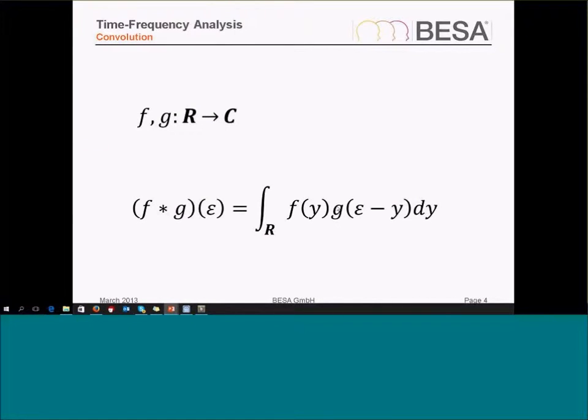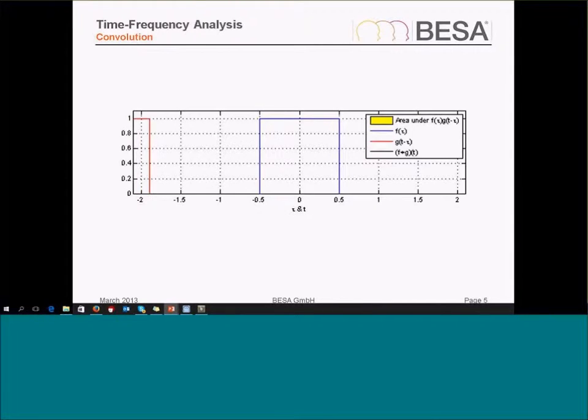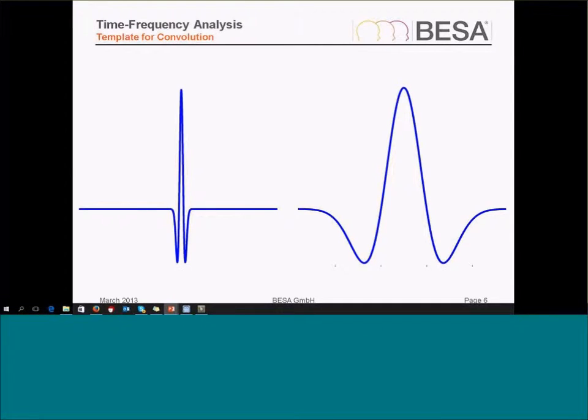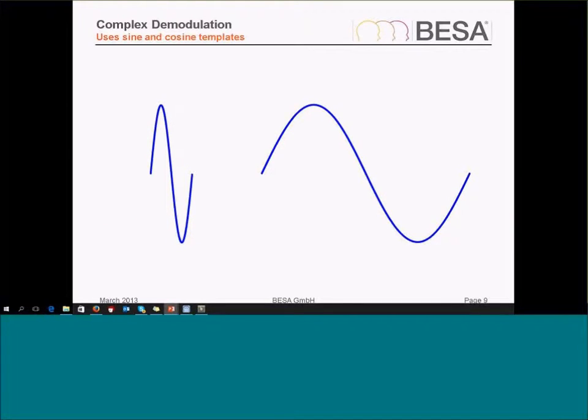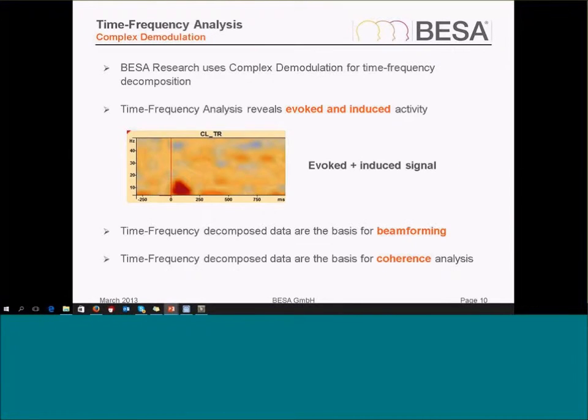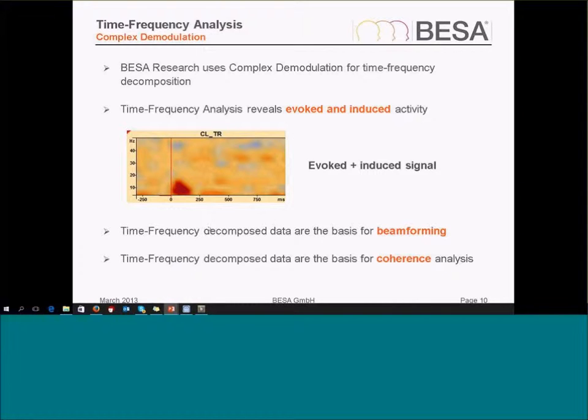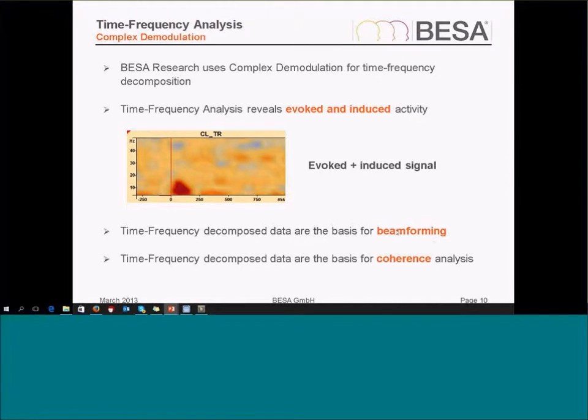We get to the time-frequency analysis results via convolution with different functions, which I'll skip for time reasons. We can use this time-frequency decomposed data also as a basis for beam forming solutions and also for coherence analysis.